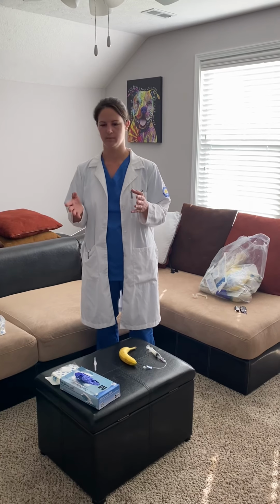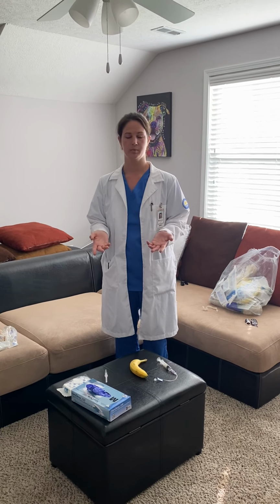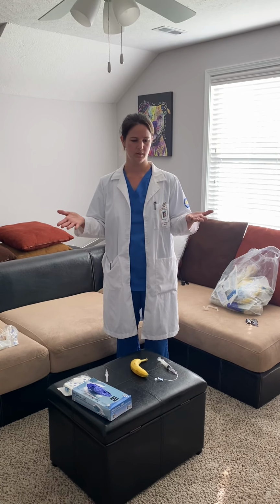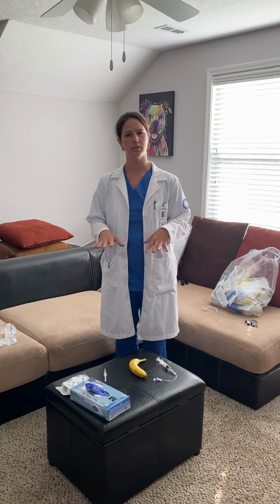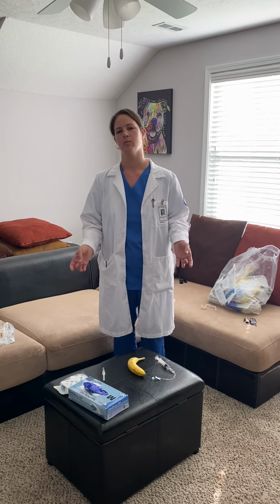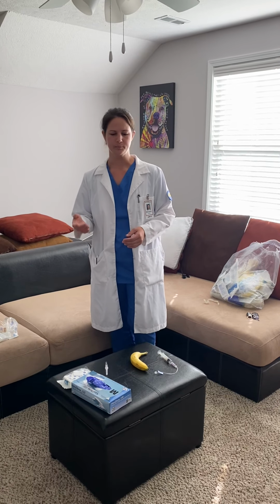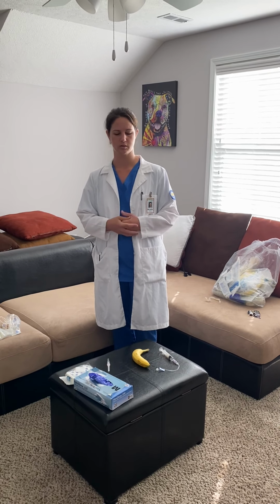do an overall assessment of my patient, overall well-being of my patient, provide privacy, and I'm going to explain the procedure to my patient, and then I'm going to raise the bed up for good body mechanics, don any PPE that's necessary, and then upon completion of the procedure, I'm going to lower the bed, raise the bedside rails if indicated on the patient's care plan, and also make sure that the call light is within reach of the client. Any abnormal findings, I make sure that I report those right away to the charge nurse.